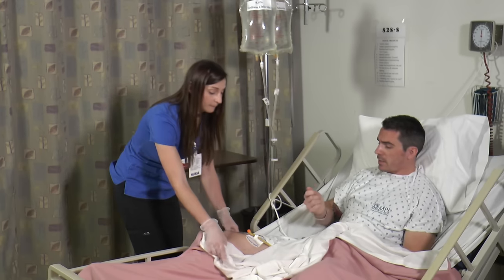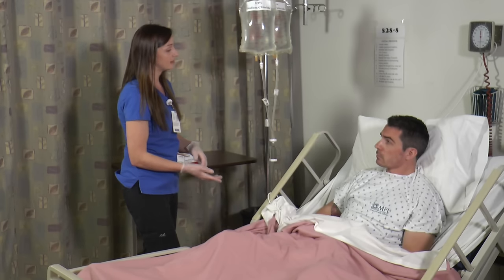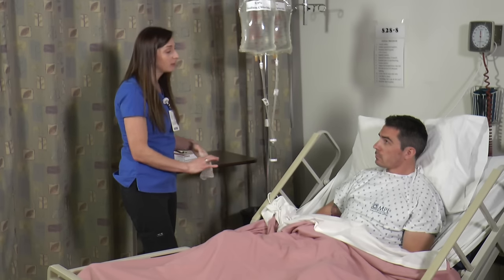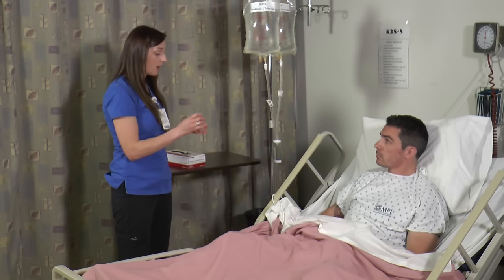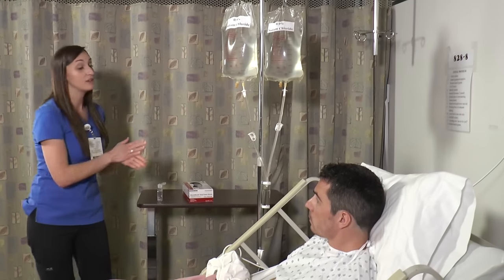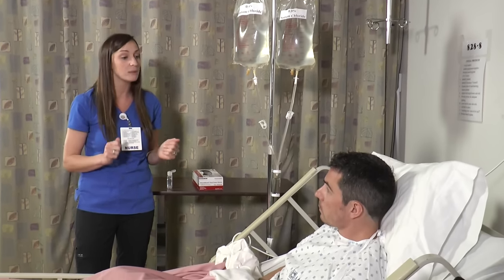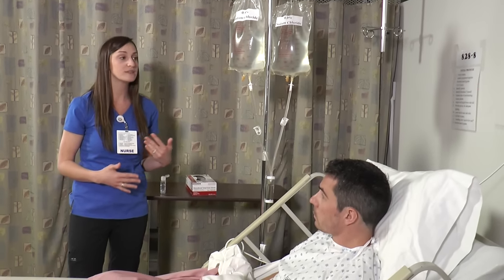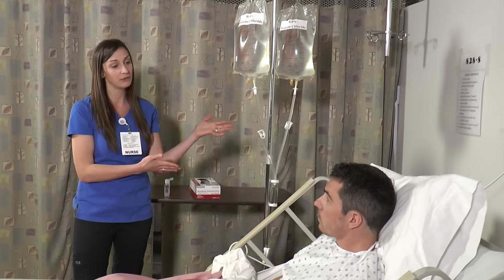But I'm also curious, why does it constantly feel like I have to urinate? Well, after a transurethral resection of the prostate, oftentimes patients will feel like they have the urge to urinate, and it could be due to a number of things. One thing that it could be due to is the spasms of your bladder. The other is the catheter in place itself, and the final reason is just irritation from the procedure that you had. The important thing as the patient is to remember not to pull or tug on that catheter, because what can happen is it can cause further bleeding, which could subsequently cause a clot that could block that catheter, which is what we're trying to avoid with the continuous bladder irrigation.